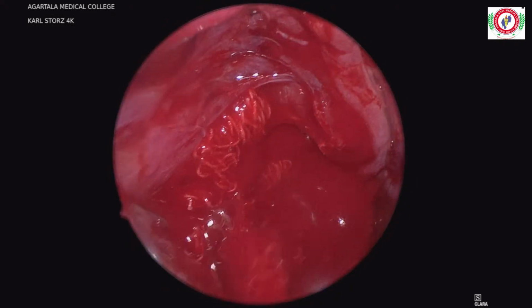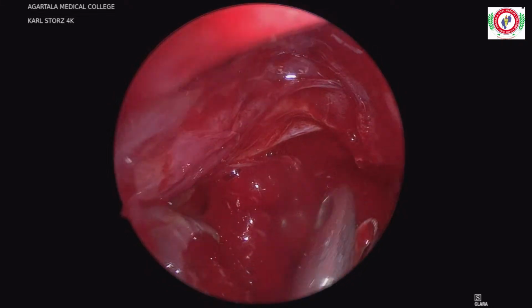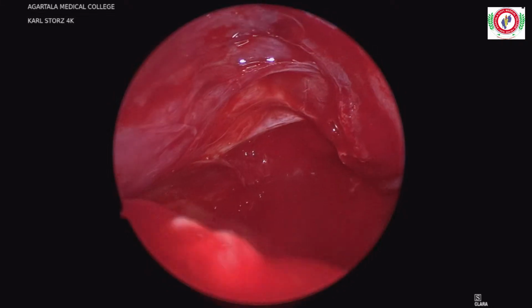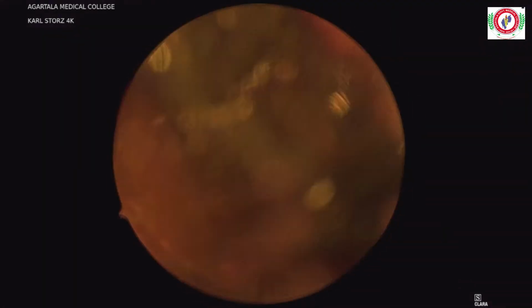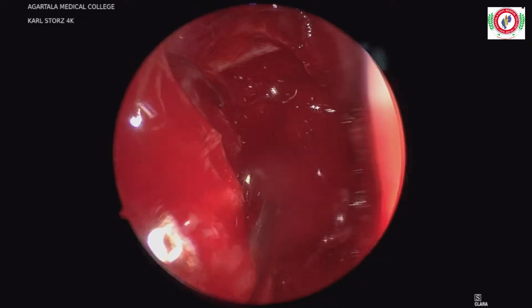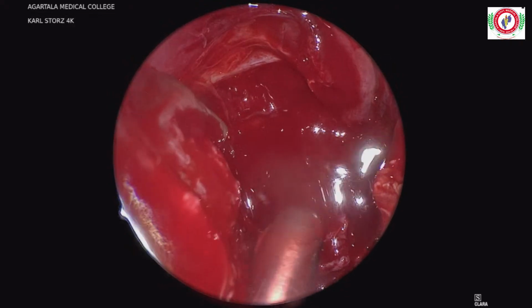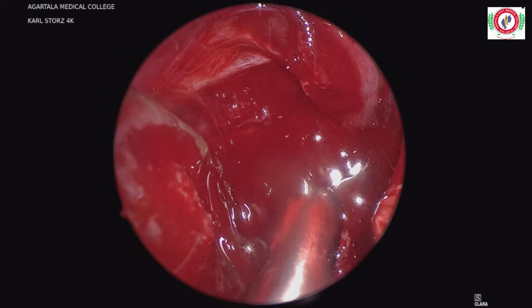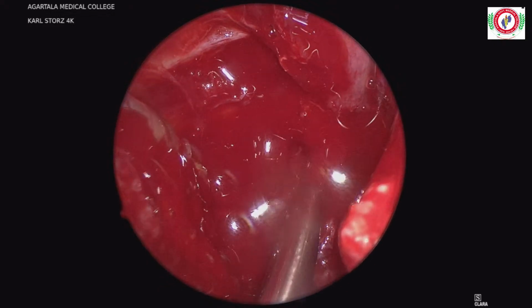That's all. No, don't put this on, man, this is of no use. Put the 15 only, the cutting edge of this one is at the back, so this will not do any justice. Okay, 45 rad though, I'll do maximum with the 45 rad, whatever I can do.